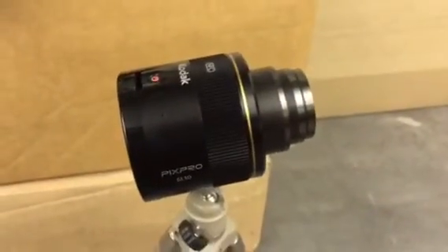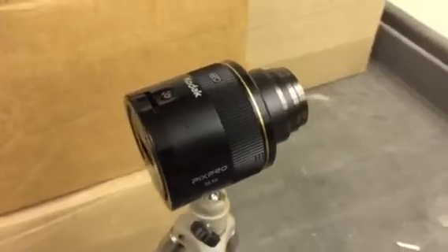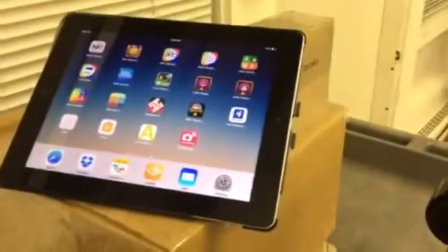Hi, this is Jessica. I wanted to show you guys something I just got. I haven't tried it out in the classroom yet, but I think it could possibly be a solution for a distance viewing device for our students who already use iPads or other tablets.